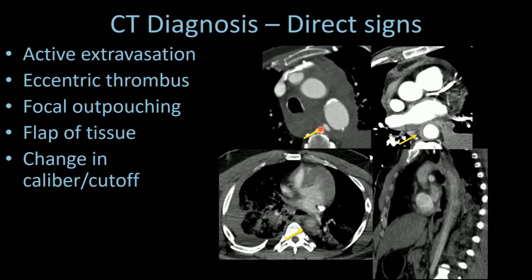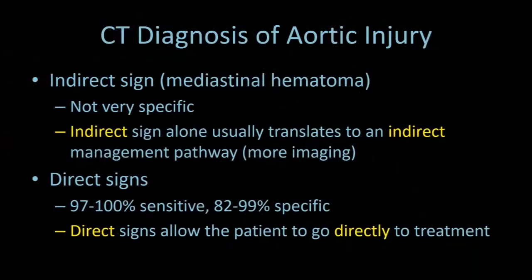This last direct sign is fairly rare. The patient on top has some contrast within the wall of their aorta with high attenuating material tracking. This is an intramural hematoma as a manifestation of acute traumatic aortic injury, blood in the wall of the descending aorta tracking up and down.